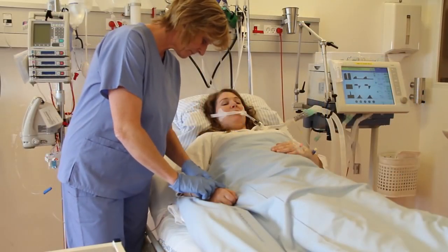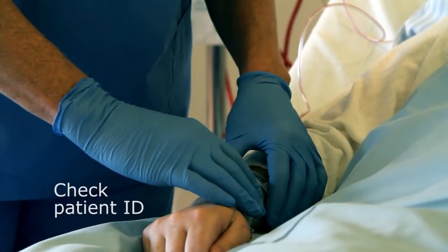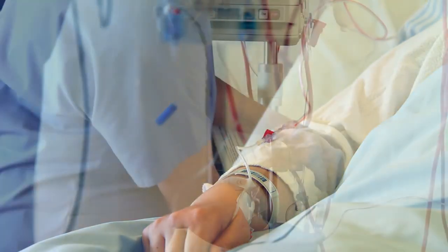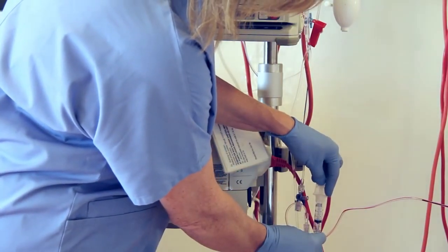Before sampling, confirm the patient's identity. If a recent change in ventilator setting has been made, wait approximately 20 to 30 minutes before sampling.